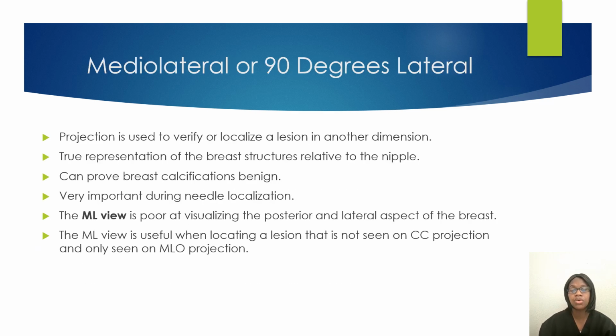Your medial lateral or 90-degree lateral picture, you will mainly do this if a patient is coming back for a diagnostic type of mammogram, whether it's for breast calcifications, a needle localization, or if a lesion was found and you are better at pulling them in medial lateral versus lateral medial.